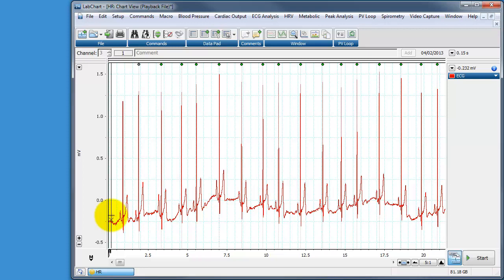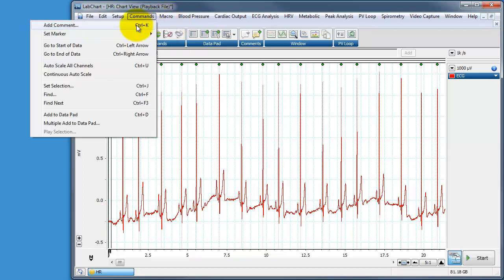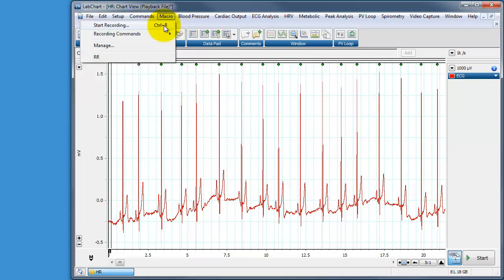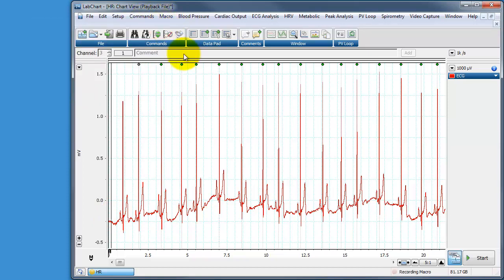So once we start recording the macro, we need to tell the computer to find the first peak once, select that as a point and then repeat until it reaches the end of the block from then on selecting the distance to the next peak. So I'll just show you how we do this very simply. We go to macro and we start recording. So you can see down the bottom right here, it says recording macro.